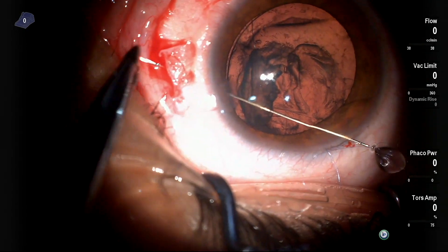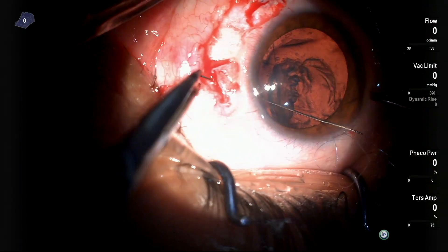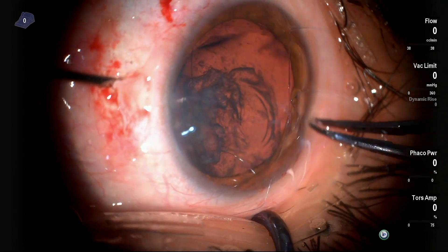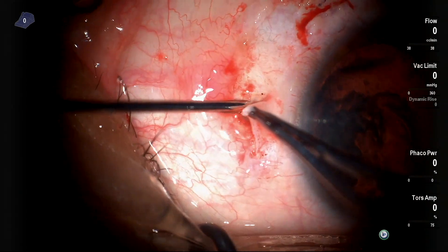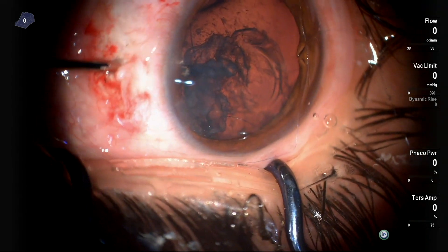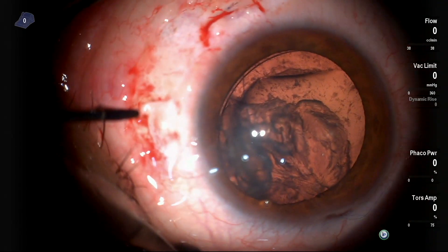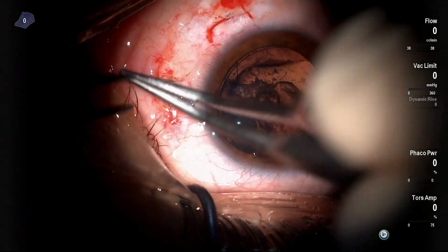This was a bit easier because the distance covered by the needle inside the eye was far shorter than the previous sutures. However, when going to insert the other needle, there was a complication — the needle was cut during manipulation outside the eye. I had to widen the opening under the scleral flap with a 23-gauge needle, then insert 23-gauge gripping forceps to grab the other end of the same suture and externalize it through the sclera.